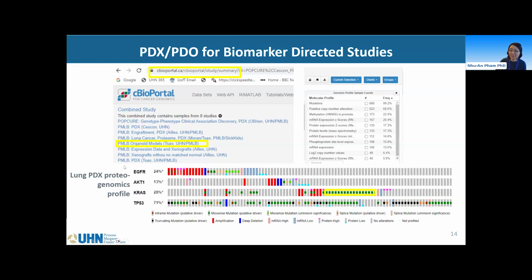So this oncoprint here is an example of the visualization that is supported on this portal. So you can select for your models and the gene panels of interest, and it will showcase it as an oncoprint and show the heterogeneity, for example, here across 4 genes of our lung models per column here, right? And this allows researchers to select for specific genotype for their combinations to evaluate the targeted therapies or interventions. And for example, here, one of the graduate students' project was being done on the KRAS mutant models, which I'll show on the next slide.